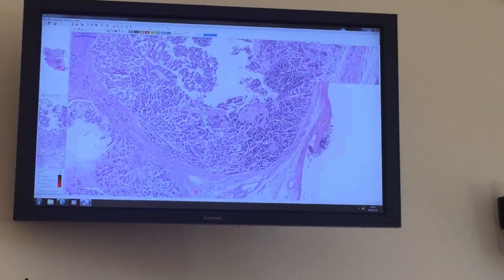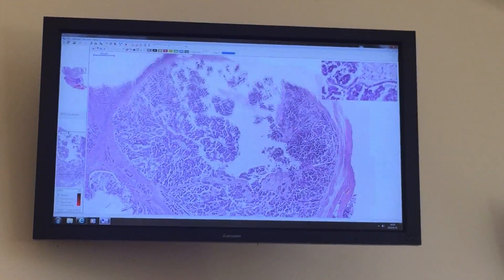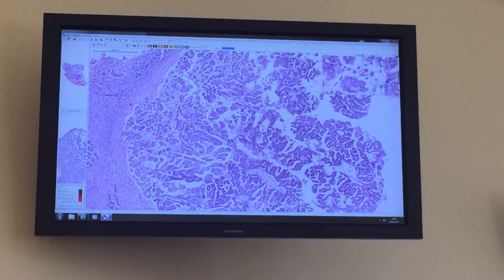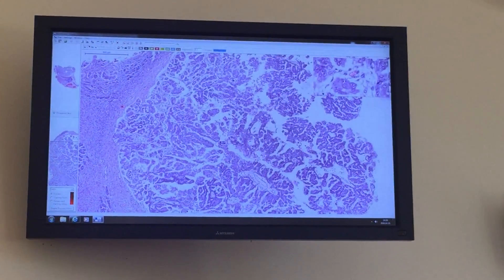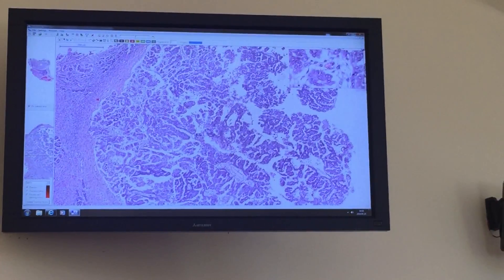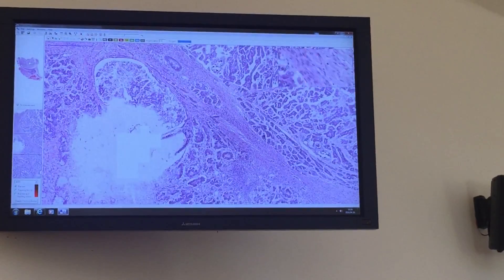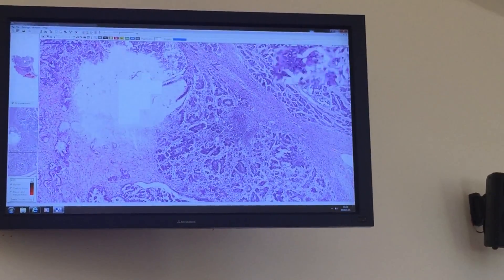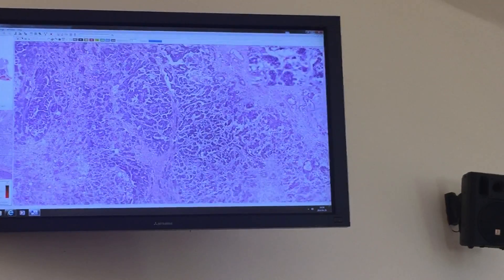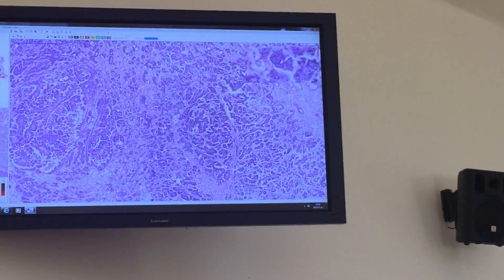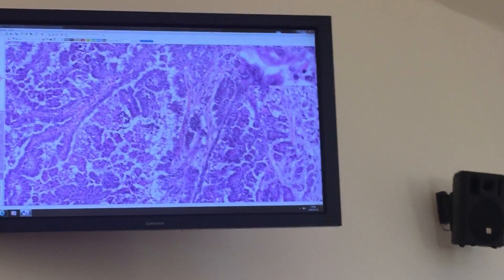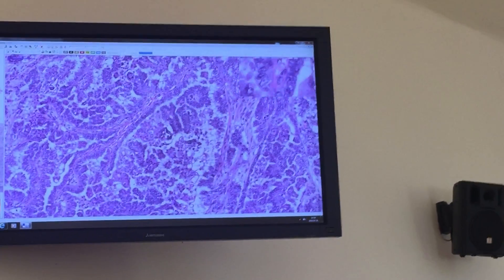If we go closer, we will see this papillary proliferation. You see the papillae — in the core there is the fibrovascular core, and on the surface of the papillae we see the columnar cells.